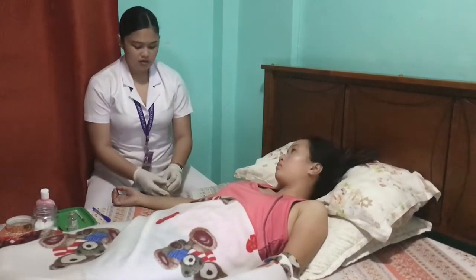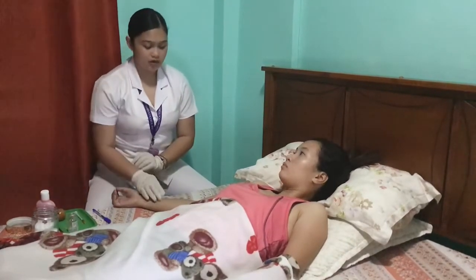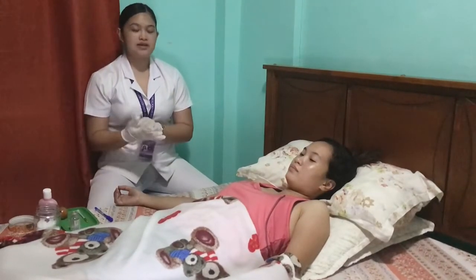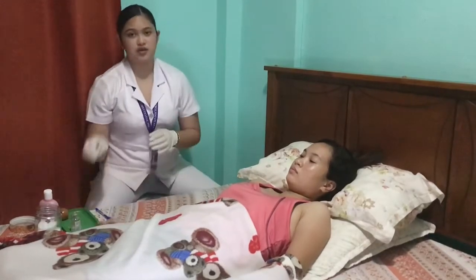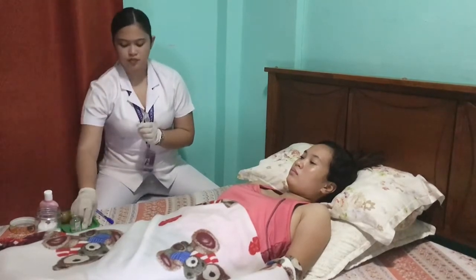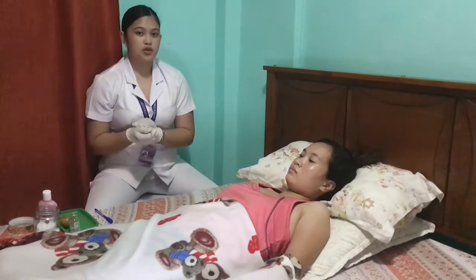So, ma'am Dayan, we're done. So, do not rub or erase the marked area of your skin. Yes, nurse. So, now assist the patient into a comfortable position. And don't forget to not use the needle again and put it in a trash can together with the cap. Then don't forget to perform hand washing.